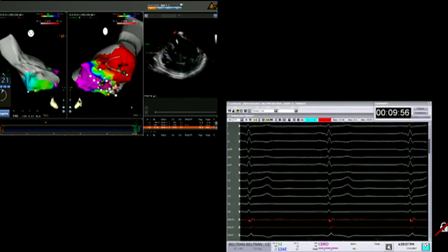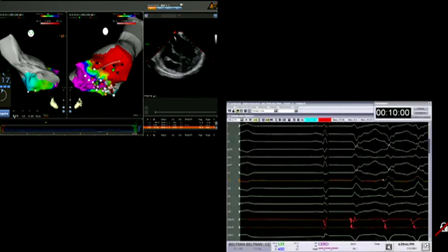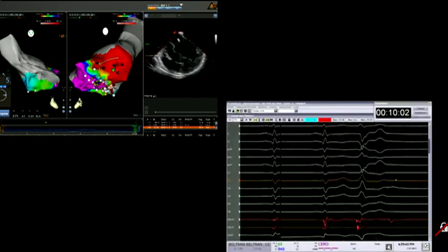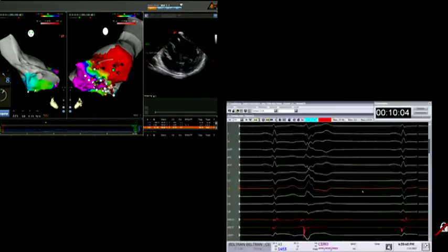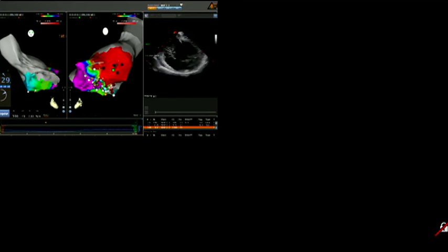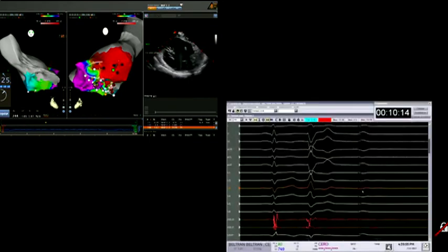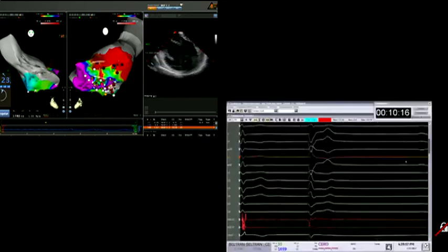We're going to keep going with the map. Yeah. It's point by point, so it's going to take a little while. Hopefully not too long. Okay. Please, can you check why the PRUC image is not fixed?